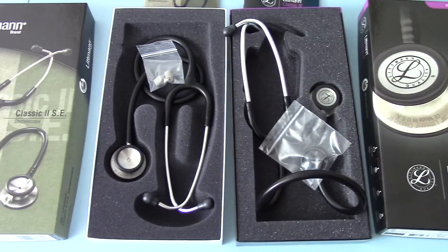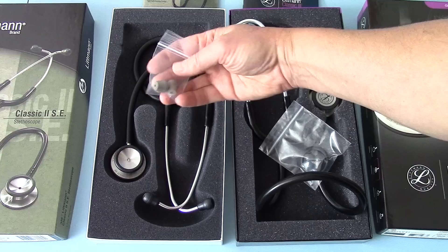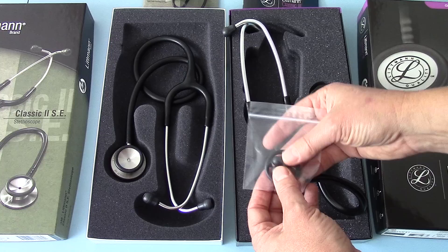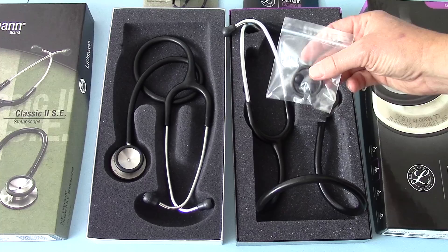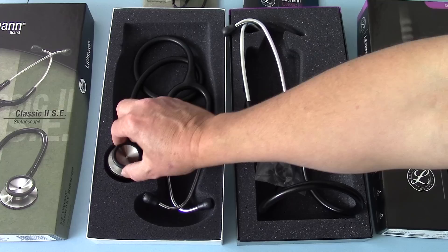Comparing the spares packs: with the Classic II SE the only spares included in the pack are a pair of small firm ear tips. With the Classic III you get a spare set of soft large ear tips, and you also get a ring for placing on the small side of the chest piece to convert it from the standard diaphragm setup — which is new compared to the Classic II SE.